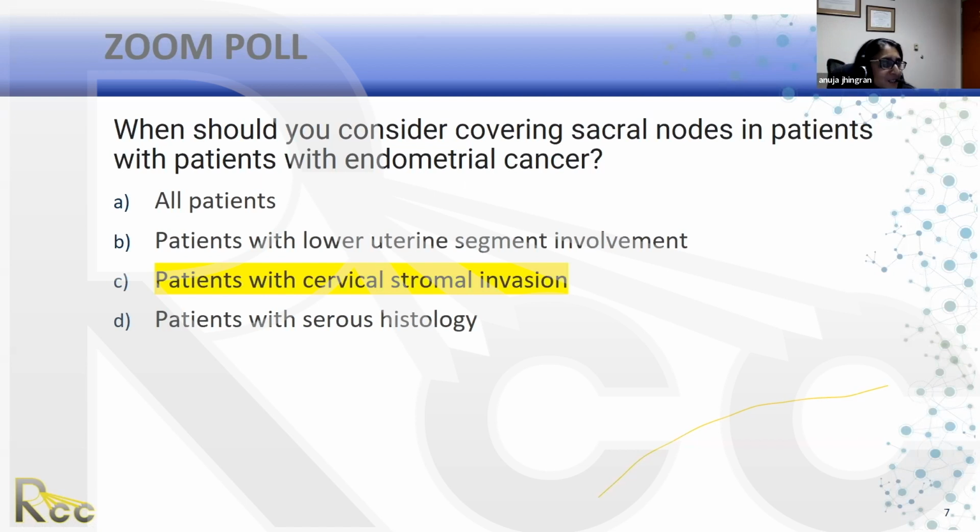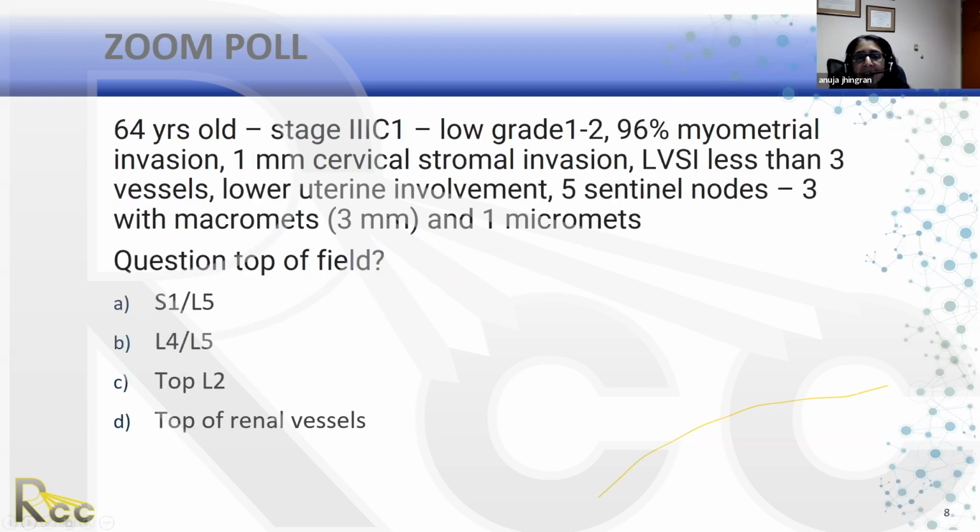Yay, good answer. All right, so like I said, we're going to go through all the questions first, and then we're going to go to contouring, okay? So the next question is one I'm asking because I want to know the answer, and you guys are actually going to help me. This is a patient that I am contouring right now. I'm going to let you know right now, there's one wrong answer, but there's no right answer. There's one true wrong answer, but the other three are probably correct.